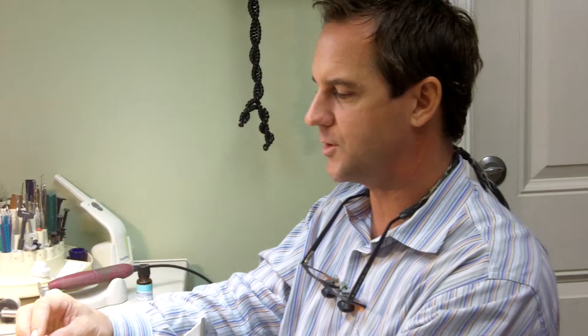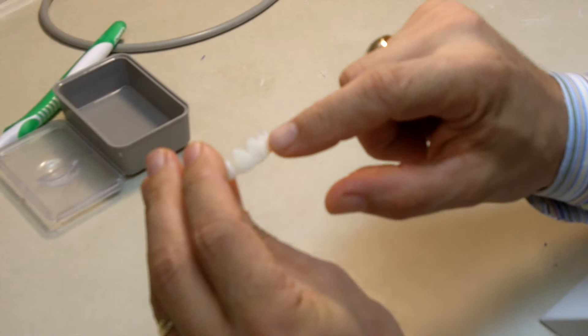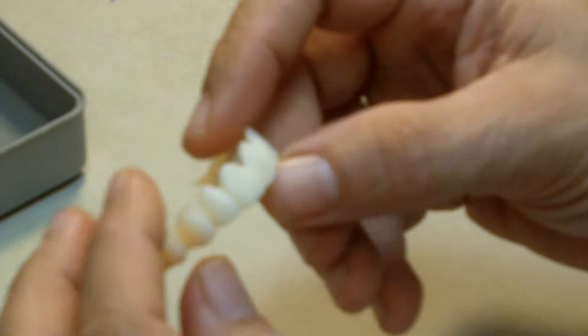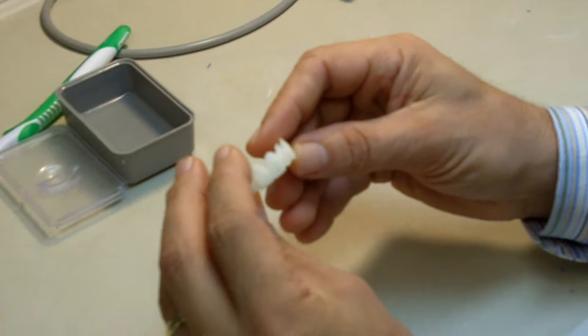I have a full arch provisional here that I just pulled from the Siltec, and I don't like this little bleed-through spot on the central right here, and I got another little bleed-through spot. So I'm going to need to reline it, and I'm going to show you a couple of tips on adding composite to a BIS-GMA provisional.